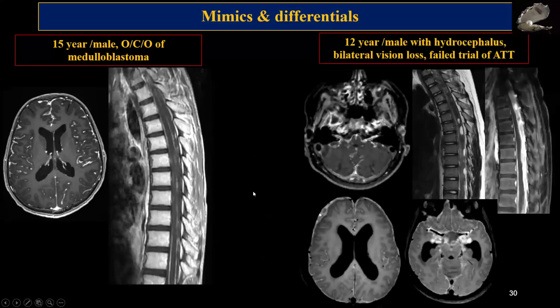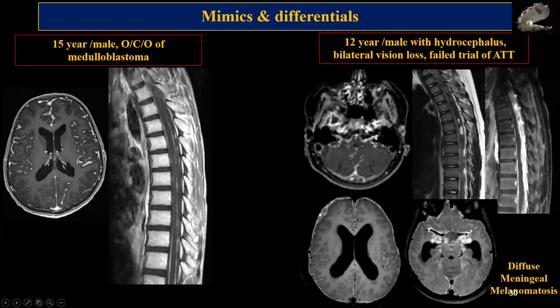Look at the spine imaging — even spinal meningeal involvement can be seen. This particular patient was on ATT for two years with failed treatment. It is very important to look at the T1-weighted image here: the meningeal disease is T1 hyperintense. If you have a T1 hyperintense process involving the spinal canal, do consider diffuse meningeal melanomatosis. This case was indeed diffuse meningeal melanomatosis, and treating it as ATT was a mistake because of the leptomeningeal enhancement.